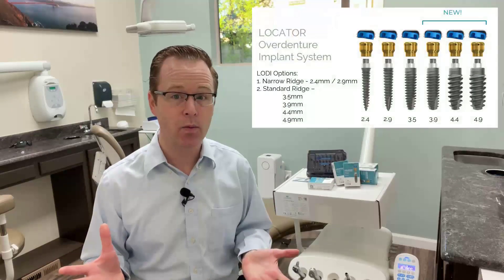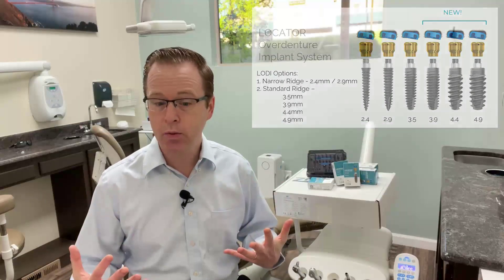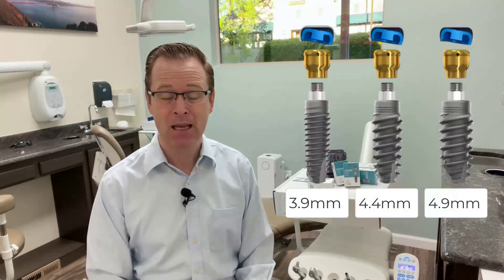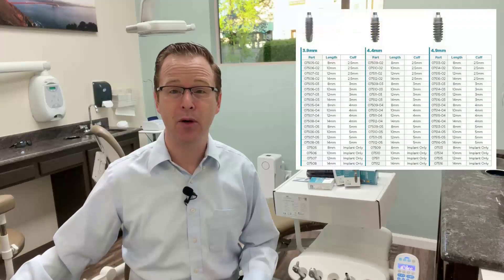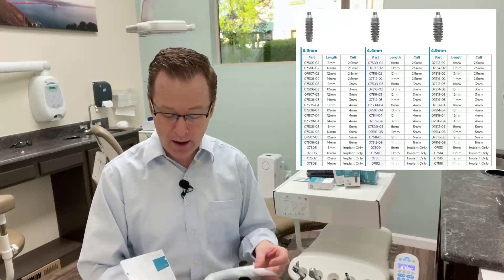Recently, Zest has been working on this really incredible update for Lodi — the expanded or extended range indication for the Locator Overdenture Implant System. Just released, and very exciting: a 3.9 millimeter diameter, a 4.4 millimeter diameter, and a 4.9 millimeter diameter. They have a huge range of different lengths available. I have my technique manual here because I have to reference it — there are so many different options.